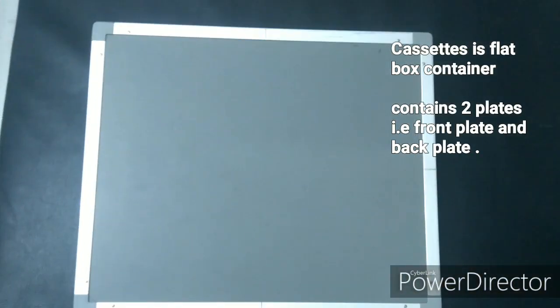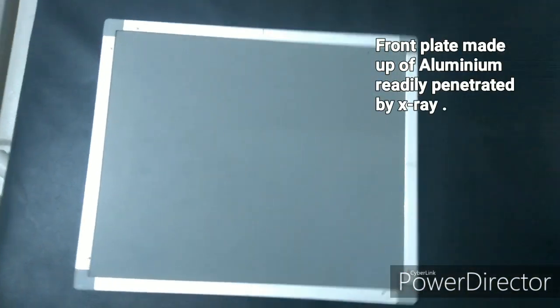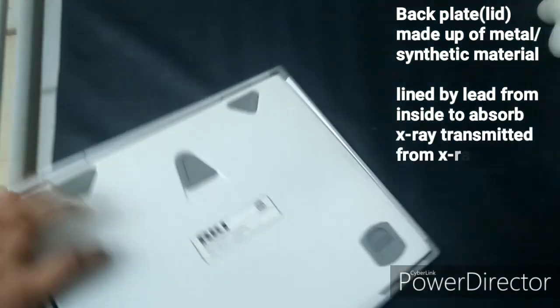A cassette is basically a flat box container that has a metal frame and two plates. The front plate is generally made of aluminium, which is readily penetrated by x-rays. The back plate is made of a metal or sturdy material, and is sometimes lined with lead from inside to absorb x-rays transmitted through the film.